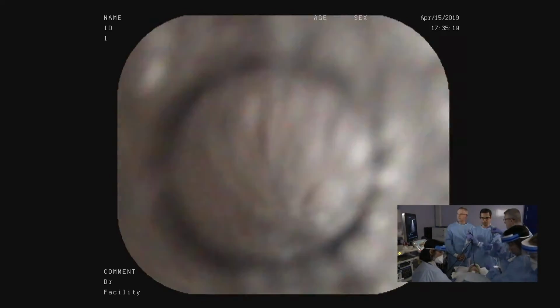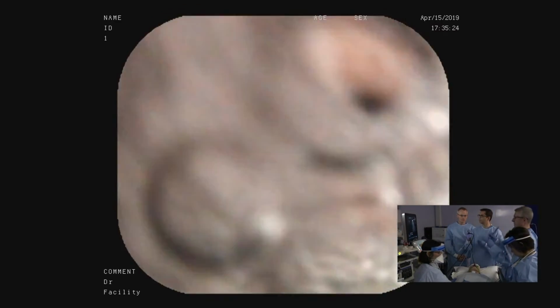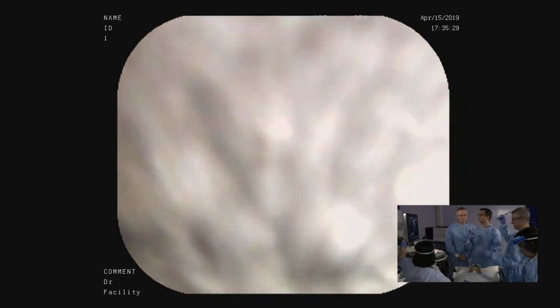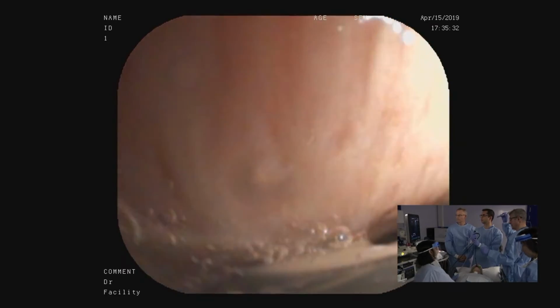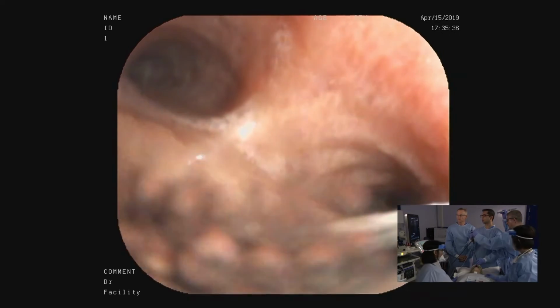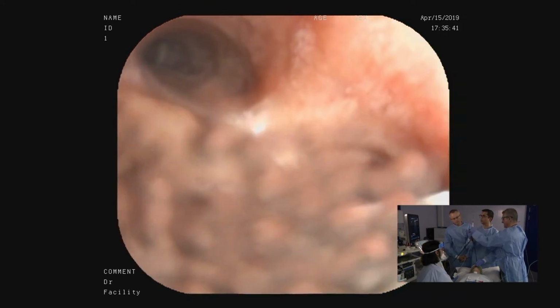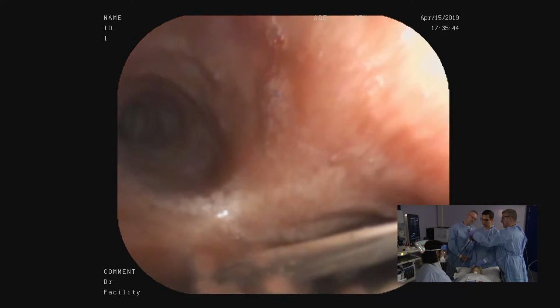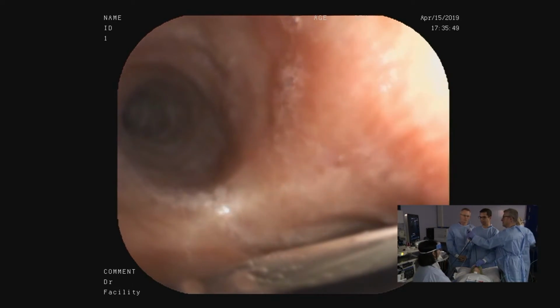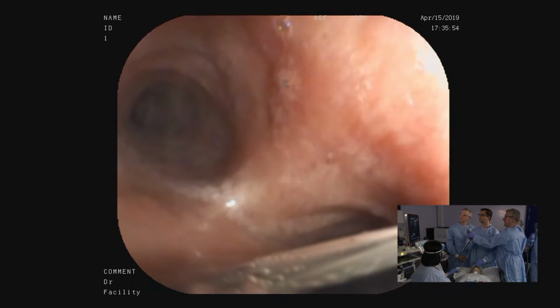And if you don't mind, because last time I couldn't give the full detailed commentary of needling. So Dave, we're just going to insert the needle into the scope now, down the operating channel of the scope. At the moment, the needle is retracted, so it's safe and hidden within the sheath. The key and most important part here is to not damage the equipment, and for that reason, you have to see the sheath visible endobronchially.